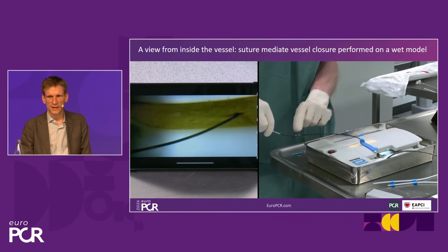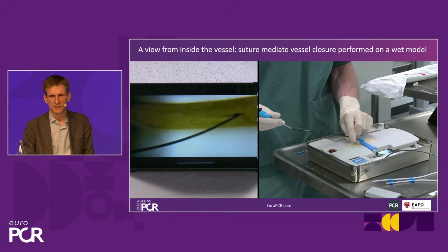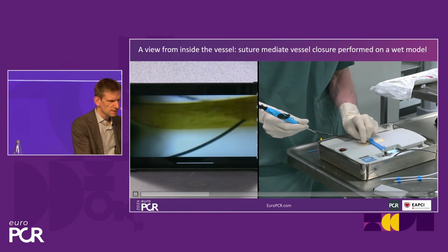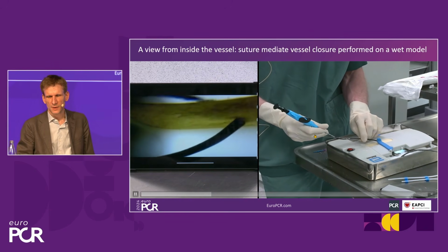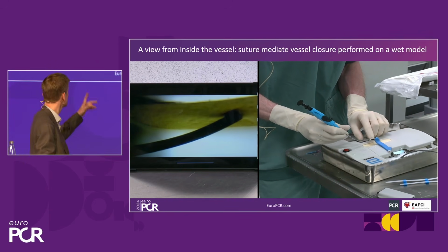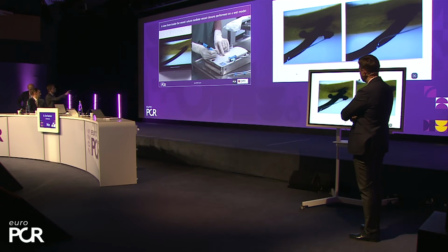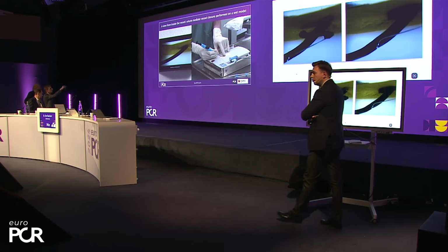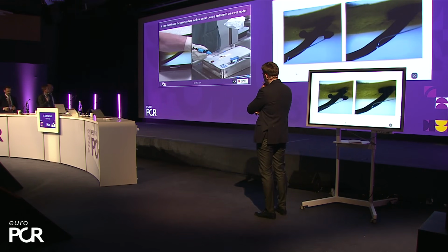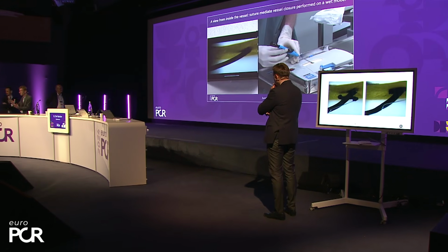Then you make sure that the wire exits on the side port, which is indicated by the white parts here. Then you go in, okay. The video is still playing there, okay, good. So we go in until the wire hub, the port where the wire goes in, disappears just under the skin. You pull back on the wire. And now we go in the direction, following the axis of the artery.